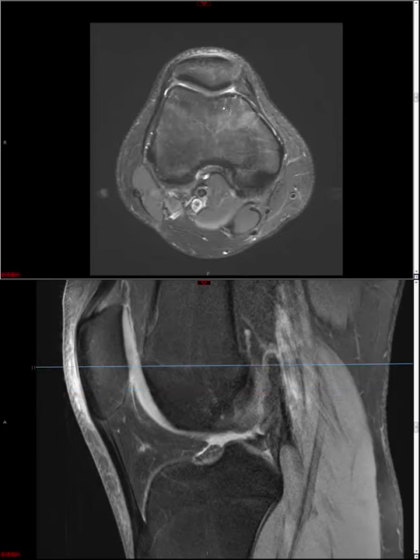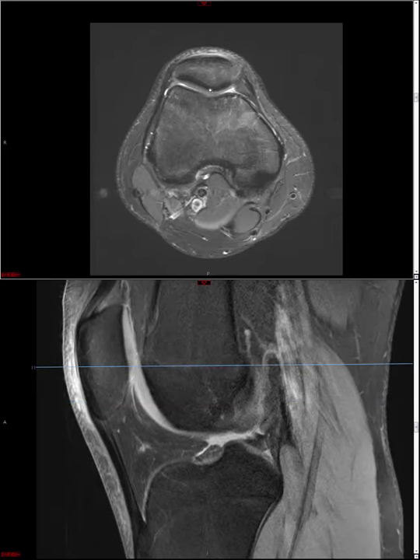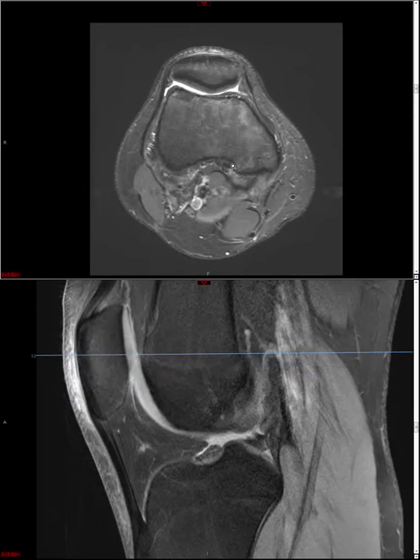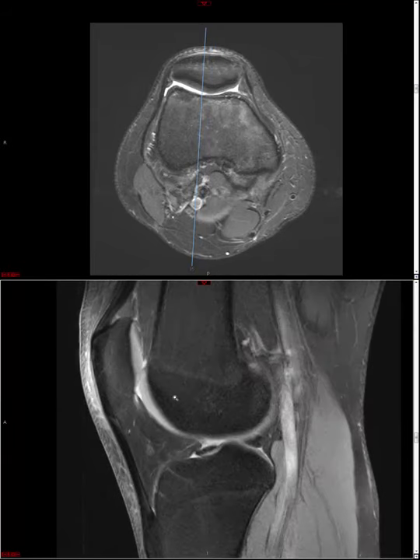If it's more long-standing patellofemoral OA and there's chondrosis everywhere, then I'll probably describe it as diffuse moderate chondrosis with focal full thickness cartilage denuding, either in the medial facet, patellar apex, lateral facet, medial or lateral femoral trochlea, whatever. Most people will use the axial to assess the patellofemoral cartilage, and I do too, but I would strongly encourage you to pair that with the sagittal, because I find that some high-grade chondrosis along the femoral trochlea, okay, can actually be quite subtle on the axial.